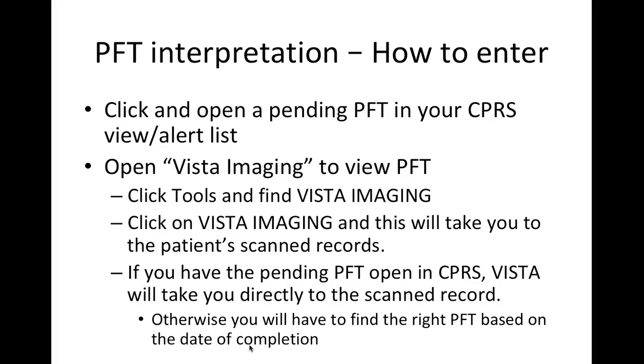Now, these are the steps on how to enter your PFT interpretation. Please ask questions when you first come over, but this should be at least an initial guide. To start, you click and open a pending PFT in your CPRS view alert list or queue. Once you have the consult open, next open Vista Imaging to view the PFT itself. To do this, click Tools at the top of the screen and then find Vista Imaging.